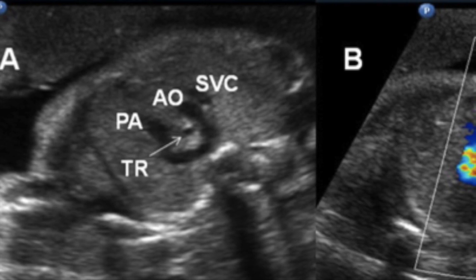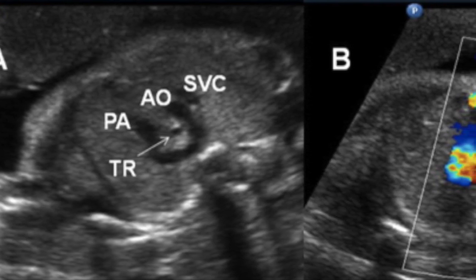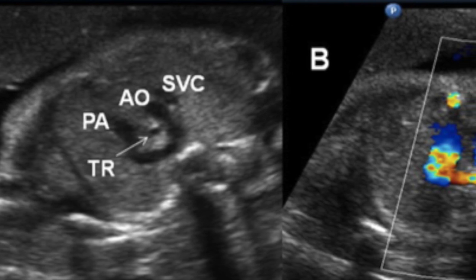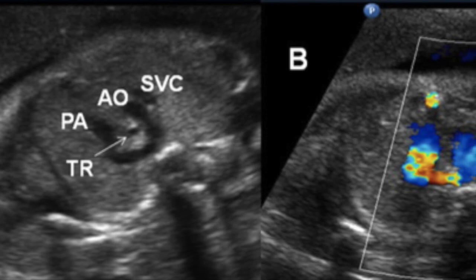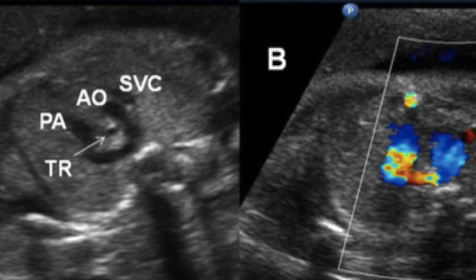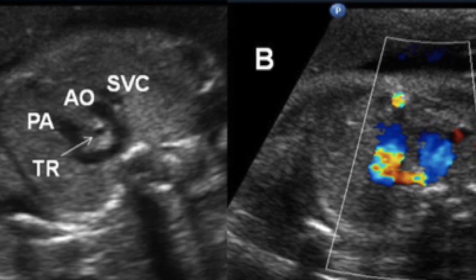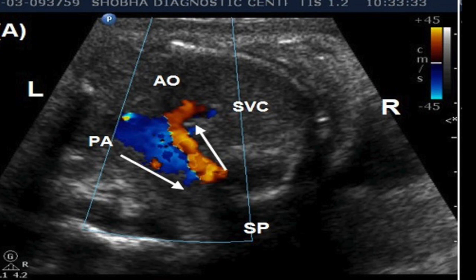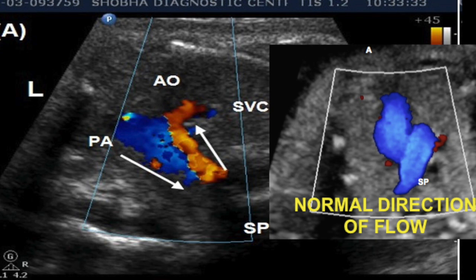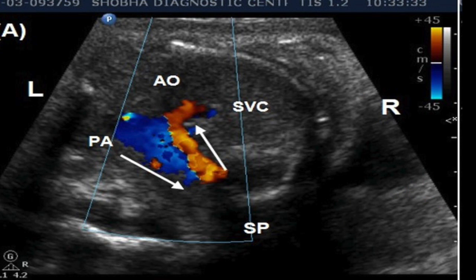Here the SVC, aorta, and pulmonary artery are visible. They should normally form a V to the left of the trachea, but instead they are forming a U-shaped structure behind the trachea — this is a right-sided aortic arch. As discussed, flow in the three vessel trachea view is normally anteroposterior. Here the pulmonary artery shows a proper flow direction, but the aorta shows reversed flow, meaning it is filling through the ductus arteriosus. This indicates something wrong in the left ventricular outflow tract or left ventricle.